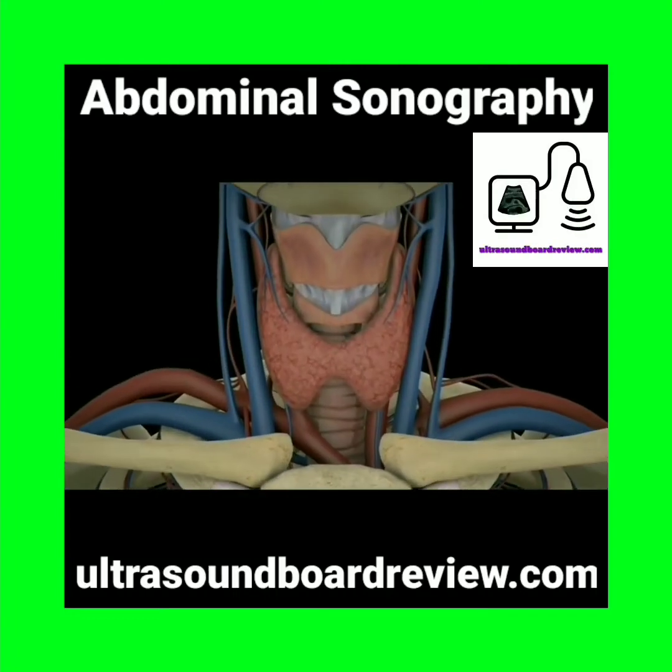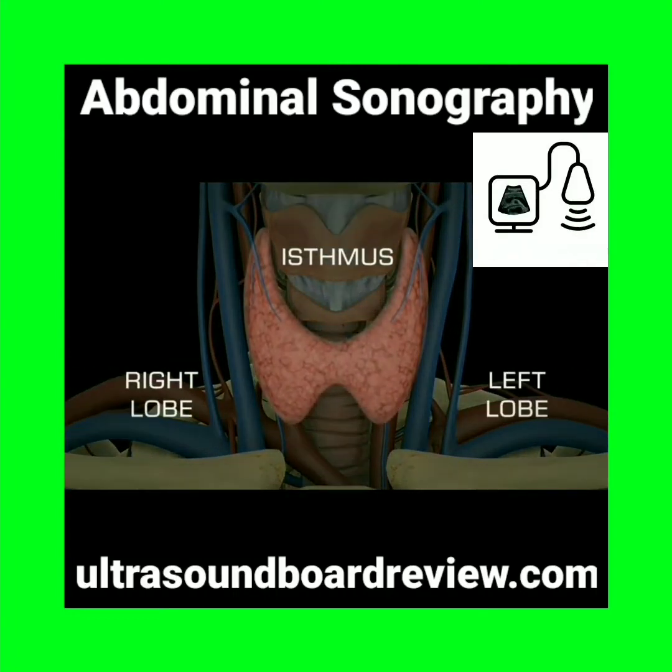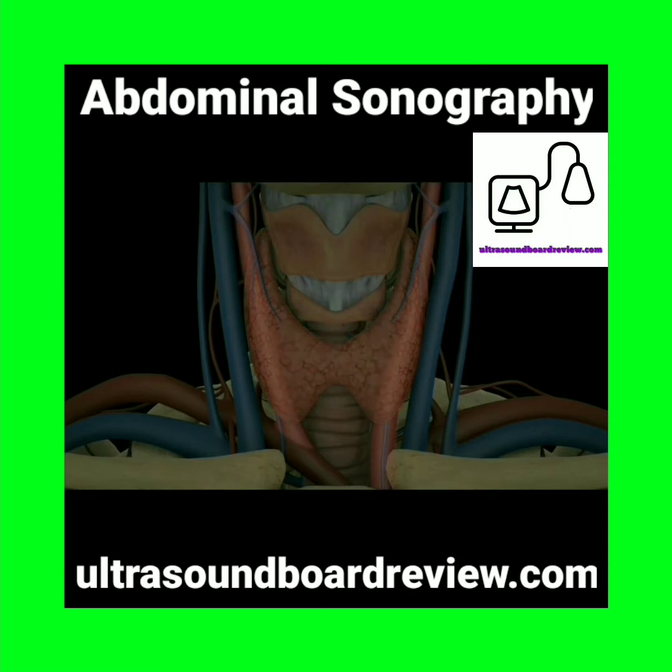The thyroid gland consists of two lobes, the left and right lobes, which are connected by the isthmus. The isthmus lies anterior to the trachea. Note the relationship of the common carotid artery with the lateral aspect of the thyroid.